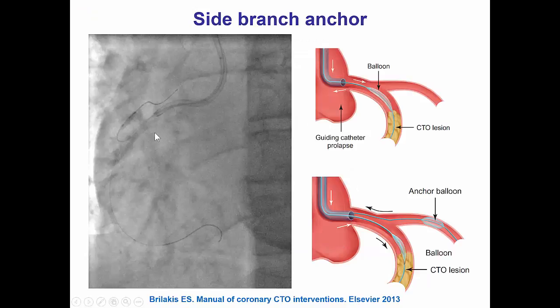In this particular patient, we did try balloons but could not cross. We did try a side branch anchor technique that provides more support for a second balloon to cross, but that was also not successful. We also tried various microcatheters but there was no success, and at the time we did not have laser in our laboratory.